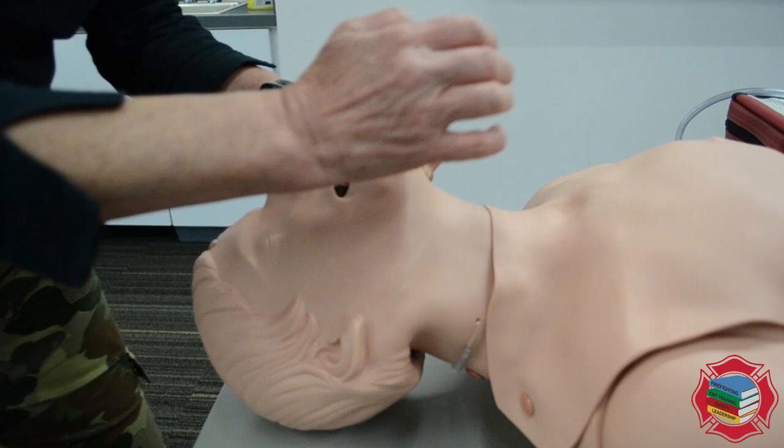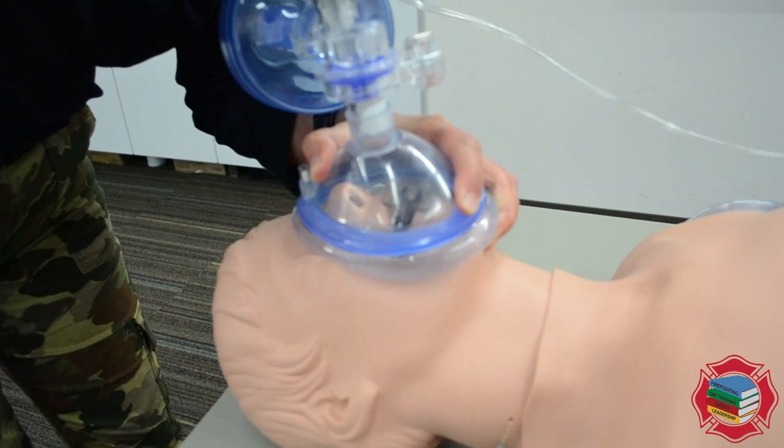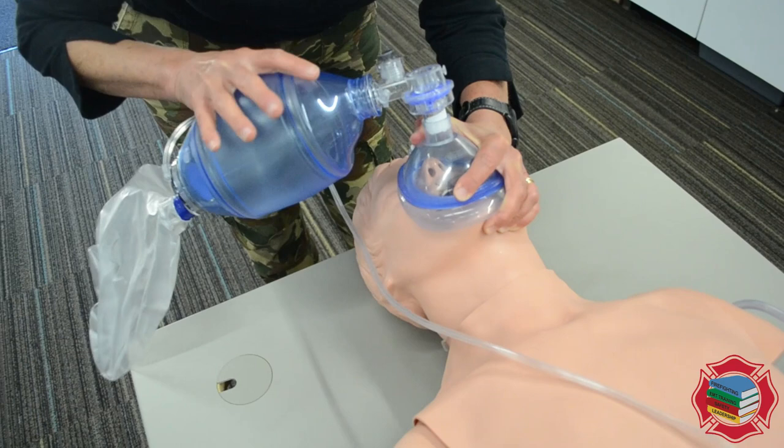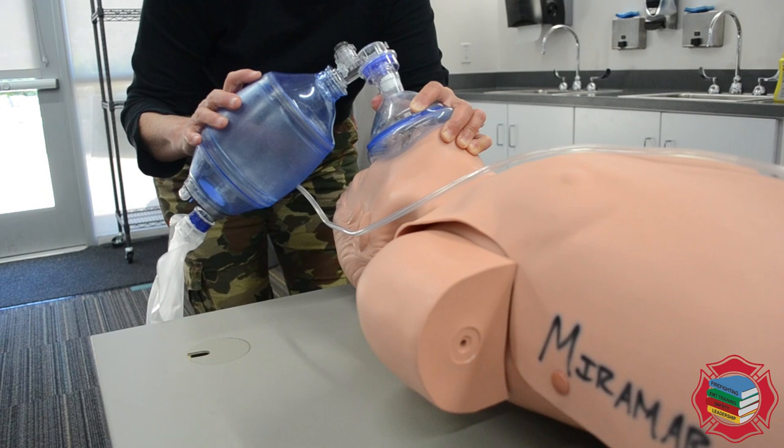Then I'm going to grab my BVM and place the mask from the bridge of the nose to the cleft of the chin, clearing the flange. You'll notice that I'm using my non-dominant hand to secure the mask to the face and my dominant hand to squeeze the bag.